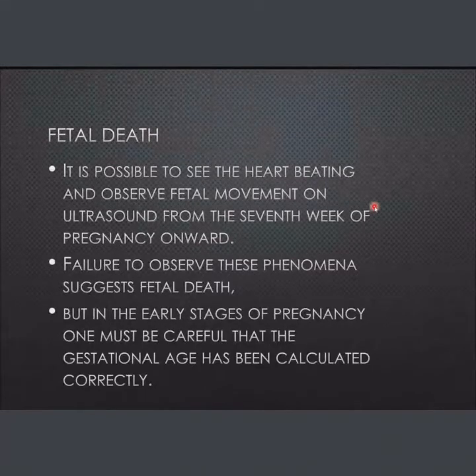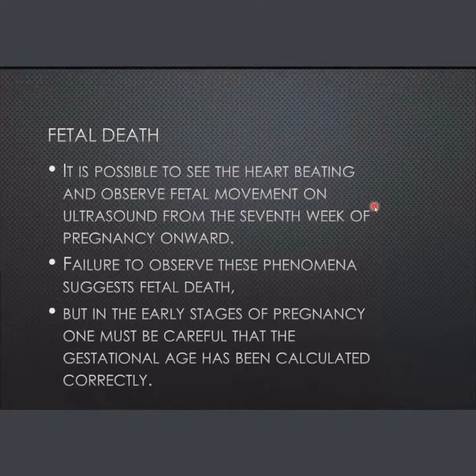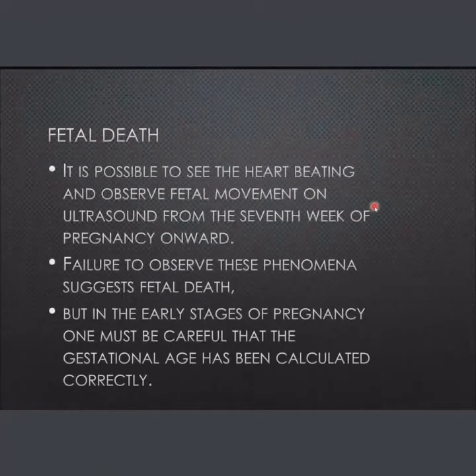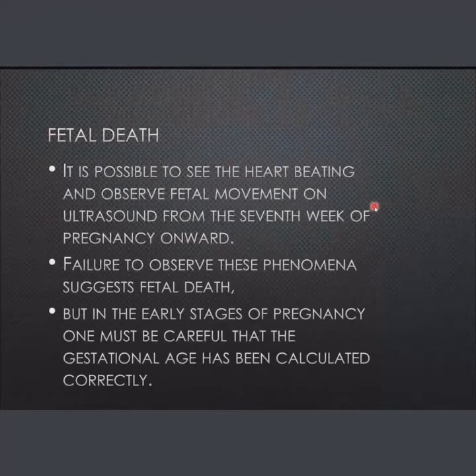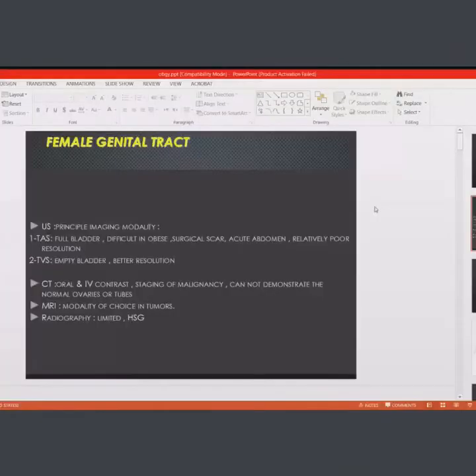So we see the fetus but no heartbeat. We cannot say that this fetus is dead because it lacks a heartbeat unless it is after 7 weeks. Before 7 weeks, even a normal fetus may not show a fetal pulse. What to do if you have about a 7 week fetus showing no fetal pulse? You will delay. You tell the mother to return again after about 10 days to confirm. If the fetus has not grown and there is still no pulse, then this is fetal death. We almost always reschedule the patient before saying so, unless she is 8, 9, or 10 weeks, more than 7, and lacking a pulse. At that time we can say confidently that this is fetal death.